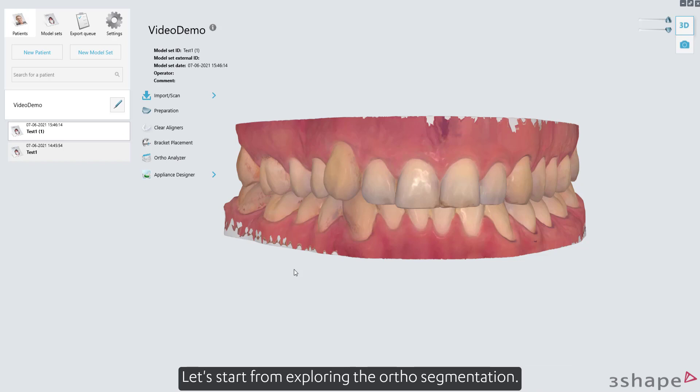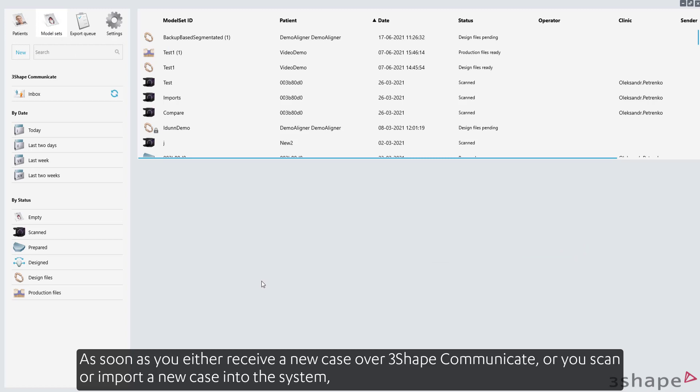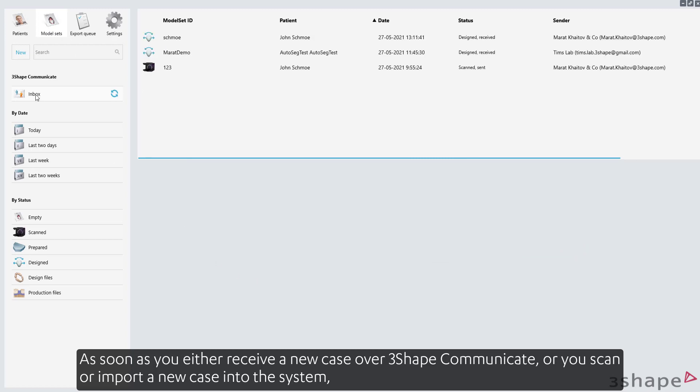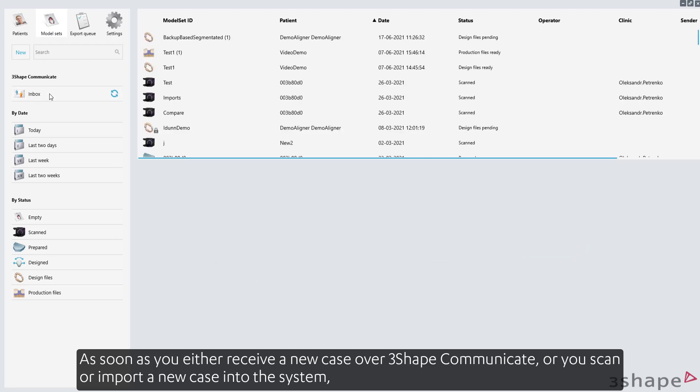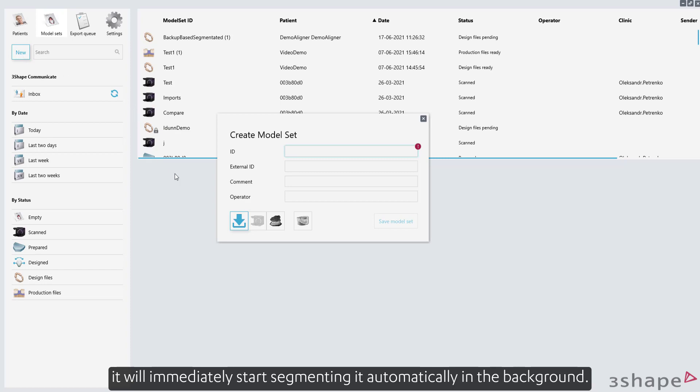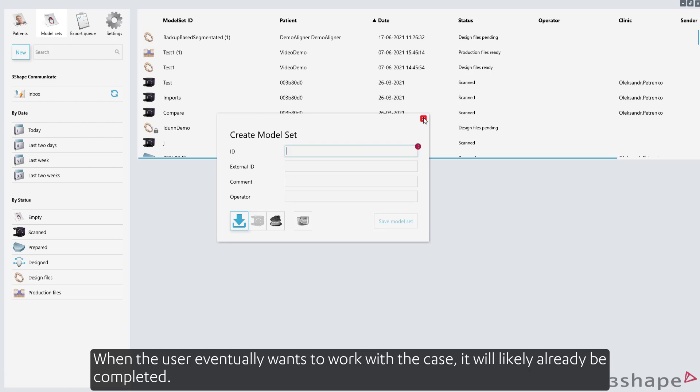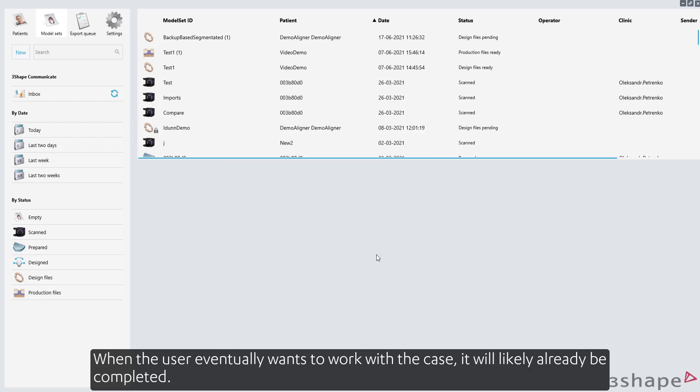Let's start by exploring the ortho segmentation. As soon as you either receive a new case over 3Shape Communicate, or you scan or import a new case into the system, it will immediately start segmenting it automatically in the background. When the user eventually wants to work with the case, it will likely already be completed.